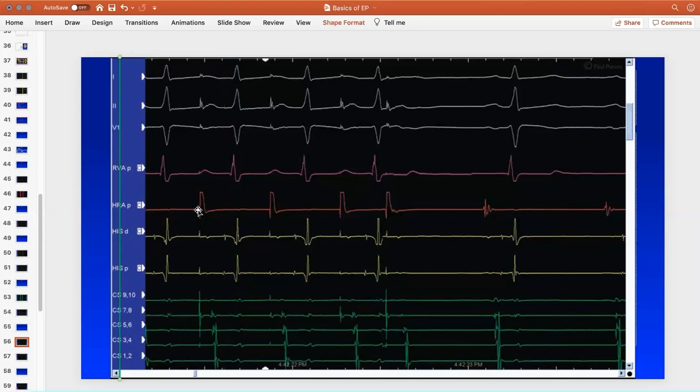So this one conducts to the V? Yes. Okay, what about this one? The fourth one doesn't conduct. Yes, so the fourth one, but did we capture the A? We captured the A, but... Exactly, we captured the A, and there are some changes, you guys don't need to know it. But we captured the A, and we did not conduct to the V.